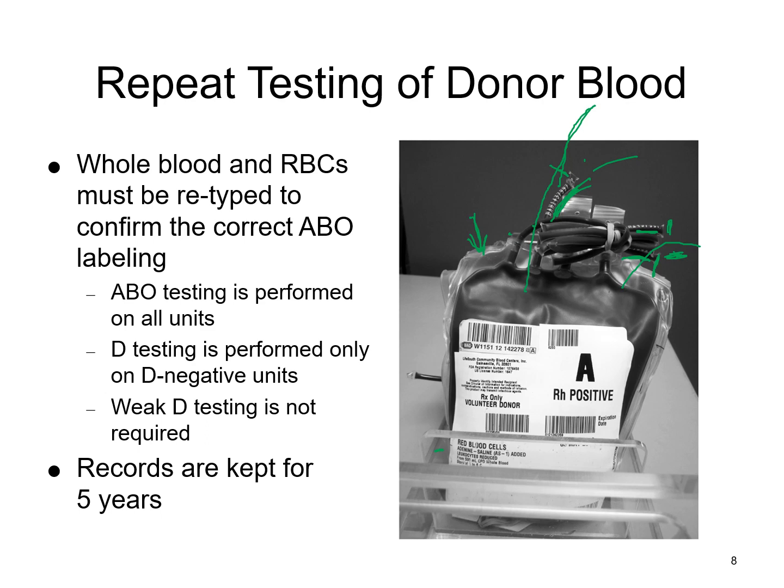If you ever have one that's loose and you're not sure what unit it came from, you can compare that number against the actual bag itself, or the number on the tubing that goes into that bag, just to confirm that it is with the right unit. So that could be some of your troubleshooting that might have to take place.